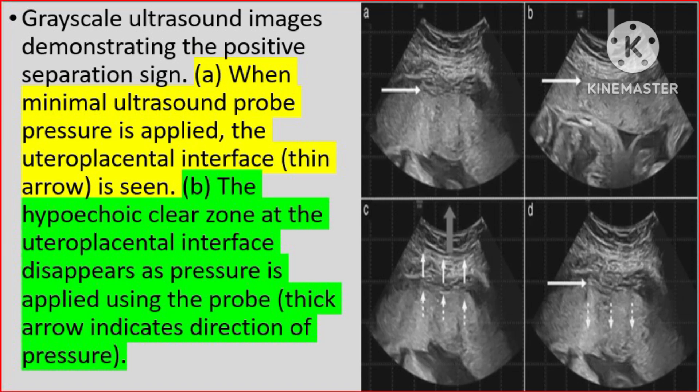Gray-scale ultrasound images demonstrating the positive separation sign. A: When minimal ultrasound probe pressure is applied, the utetoplacental interface is seen. B: The hypoechoic zone at the uteroplacental interface disappears as pressure is applied using the probe. The thick arrow indicates the direction of pressure.